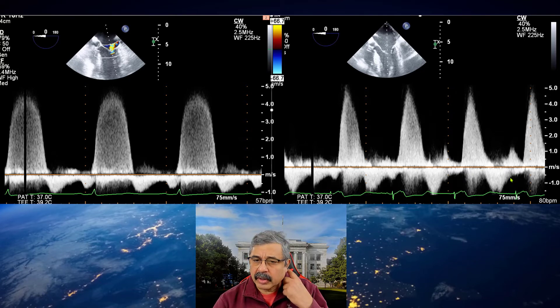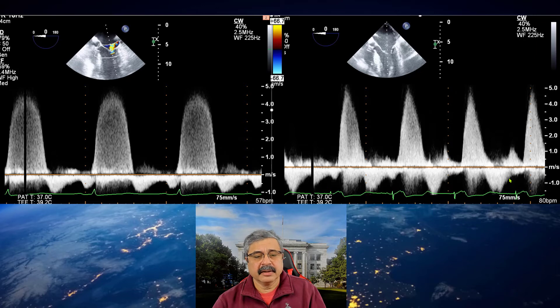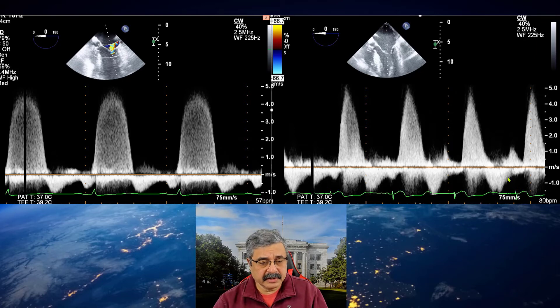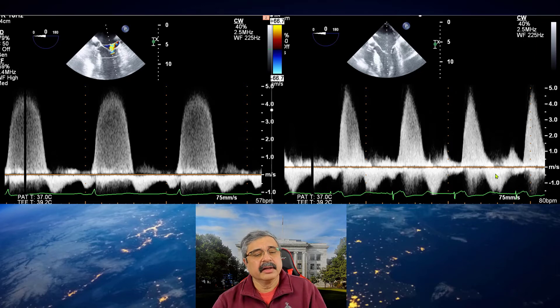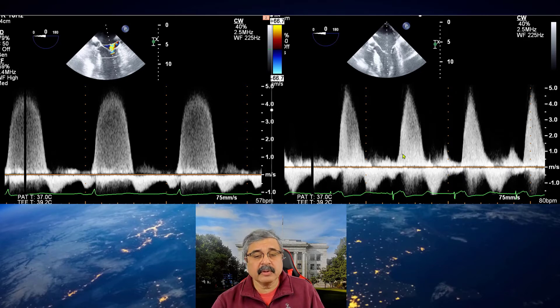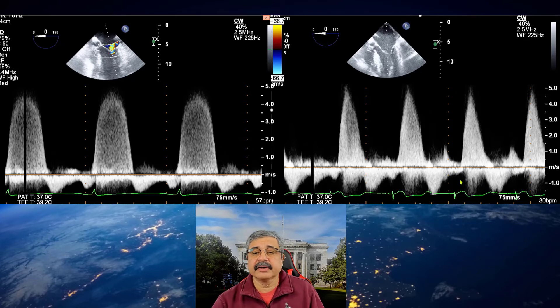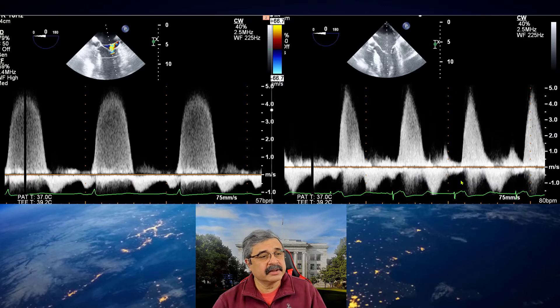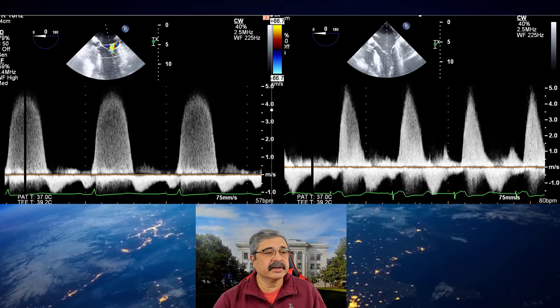So all things being equal — the intensity, the tachycardia, and the change in the transmitral flow pattern from E and A being equal to a predominantly E-dominant mitral inflow — all signify that the severity of mitral regurgitation has increased.